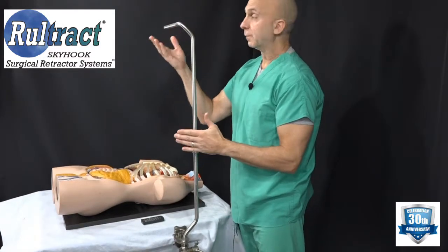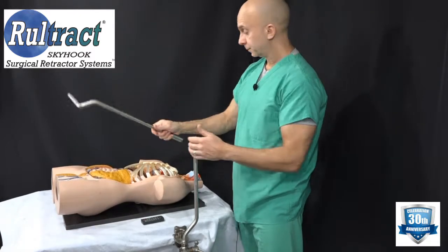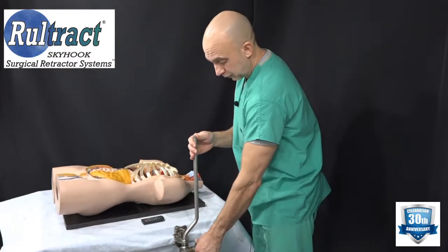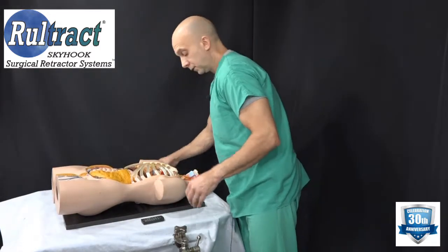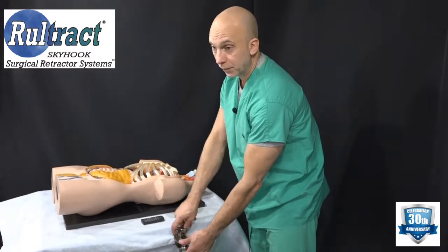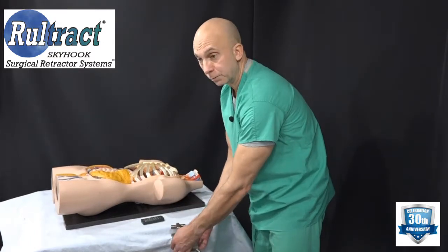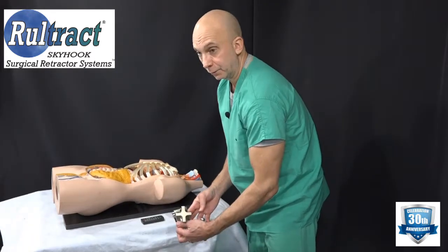Next, remove the top post — hold it by the collar and lift it. Then remove the post from the clamp by turning the wing handle and sliding it up. You can remove the clamp now or wait until after the procedure; turn the knob counterclockwise. Sometimes, because of the force the retractor was under, the clamp jaws may stick together — just shake it and they'll pop free.